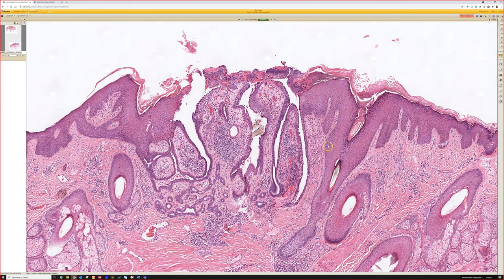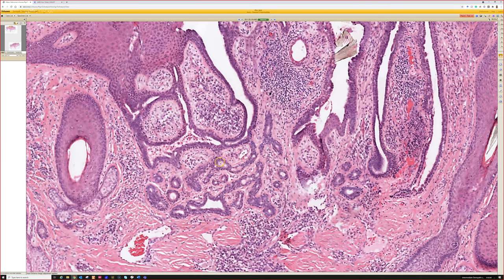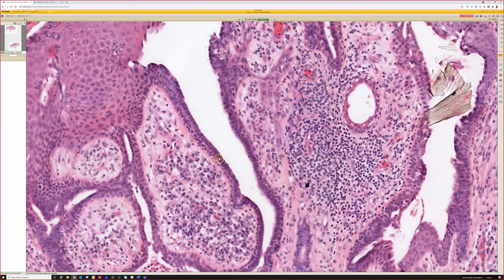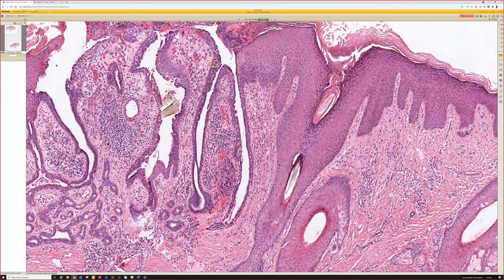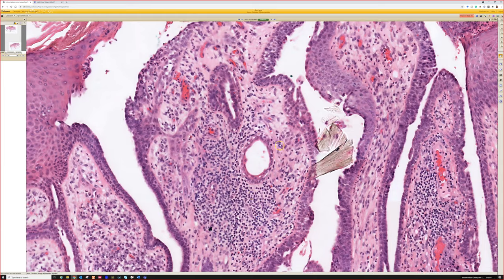Yeah, this is a beautiful syringocystadenoma papilliferum, or SCAP, and it has invaginated channels, sweat ducts that open up to the surface, and these make branching, frond-like, anastomosing channels as they go down into the dermis, and then transition sometimes to small tubules at the bottom, and they're lined by double layer cuboidal epithelium. They often have apocrine snouts on them. Can't really appreciate that here. And then the stroma gets left in between these ducts and makes papillary structures, okay? So as the ducts go down and fuse together, it leaves papillary structures that are lined by double layer cuboidal epithelium. And usually there's a bunch of plasma cells.